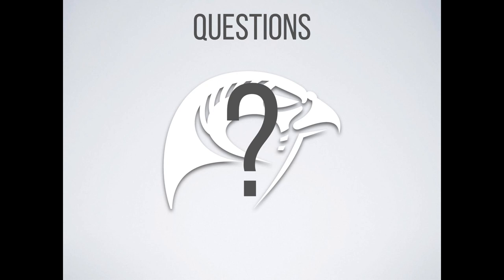Great question, and certainly something that we are paying attention to. We are also looking at ways to make sure that there are thoughtful underpinnings in the Horos application to support future application development and plugin development, and I think that those will all be a benefit to the community.